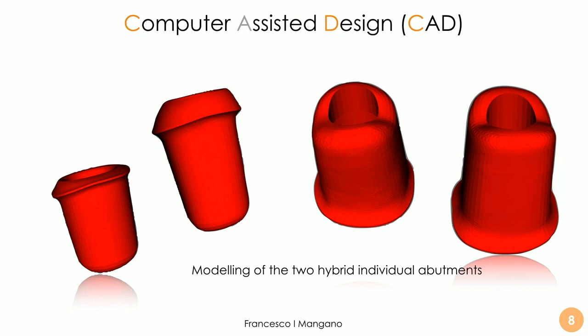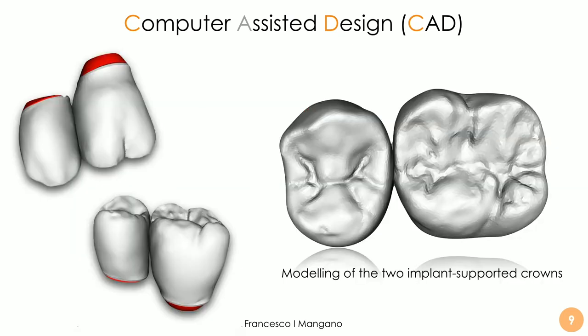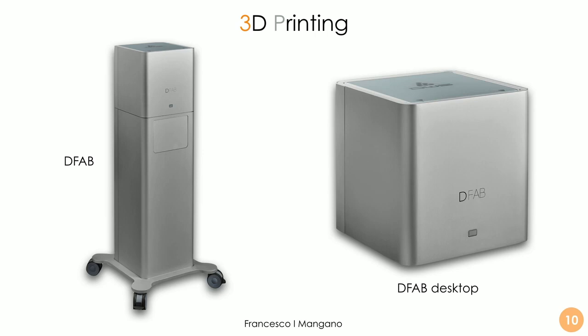We can use the modeling of the individual hybrid abutments and the crowns to finalize the whole case — as you can see, in red the individual abutments and in gray the crowns — using the DFAB in a full in-office workflow, very fast and very predictable. We have two options: the DFAB desktop without a computer — very compact and beautiful to look at — and the version with the computer inside, the DFAB version.